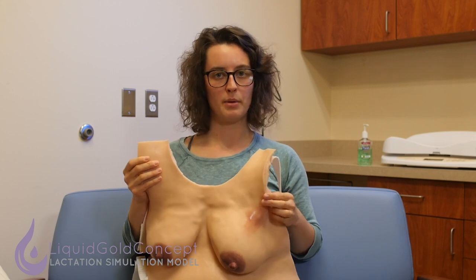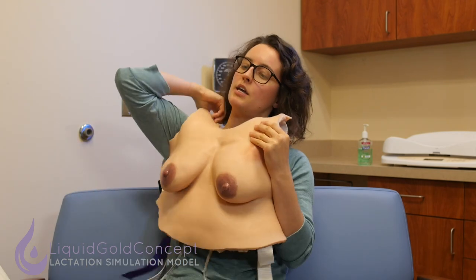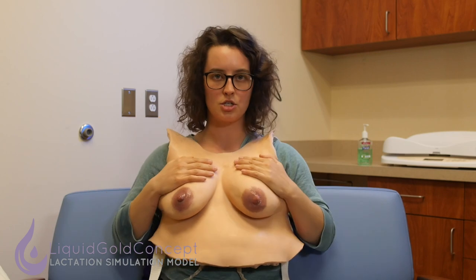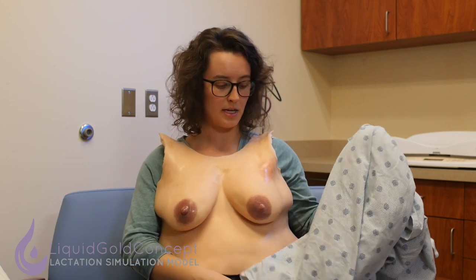The essential is really good for learning about the basics of breastfeeding. Just like last time, you want to have your patient put on the LSM, make sure that the straps are comfortably adjusted and the breasts feel evenly positioned on the patient. You can also bring a gown for appropriate draping during the breast exam.